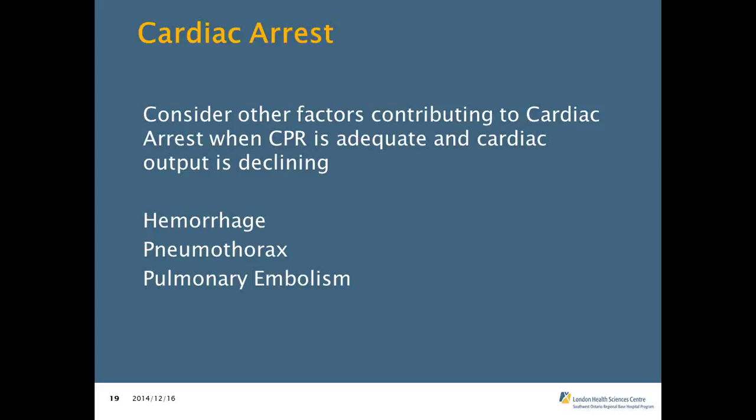So it's not going to be able to deliver that CO2 to the lungs to get to the alveoli to expire it. So with a pure pulmonary embolism, the waveform would typically look like a normal tracing, except you'd have a lower CO2. Again, no one's going to ever diagnose a pulmonary embolism just based on capnography alone. There's going to be multiple things going on, so it's just a very small piece in that puzzle.